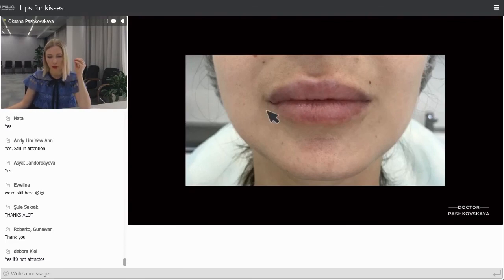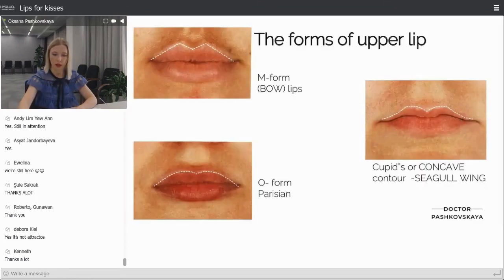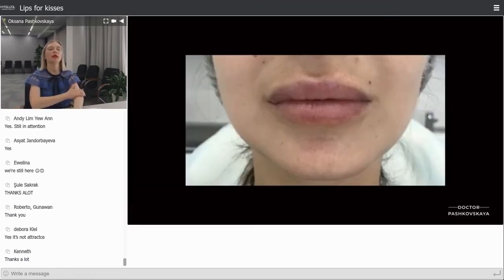It's difficult when working with lips, and I recommend to all my students and colleagues to use really soft fillers which are safe, which you can remove easily with hyaluronidase. And I would also like to tell you some words about Alexa fillers.